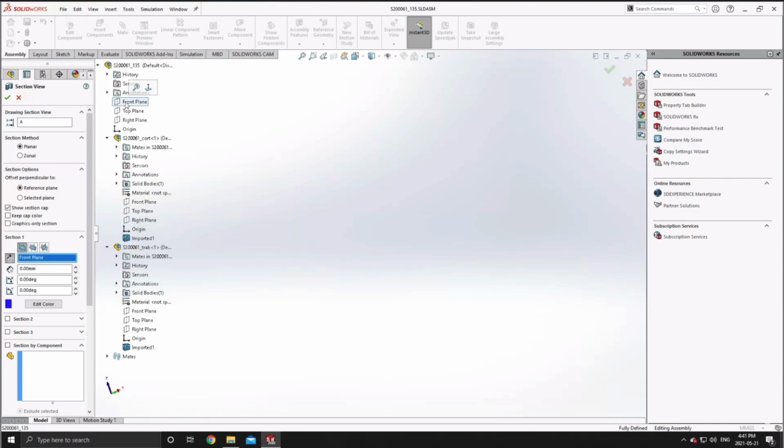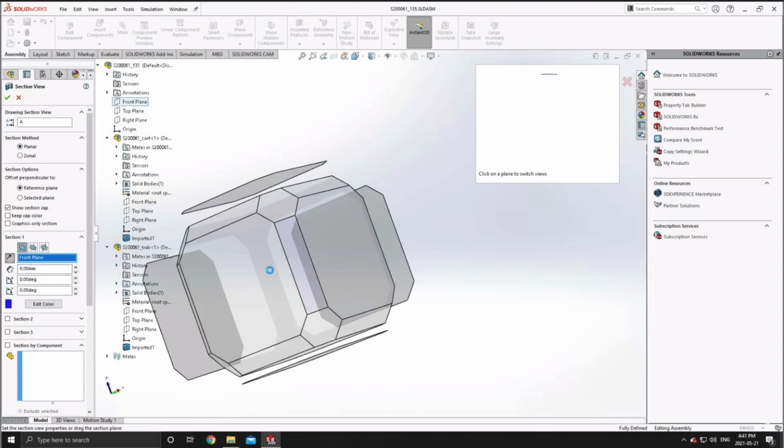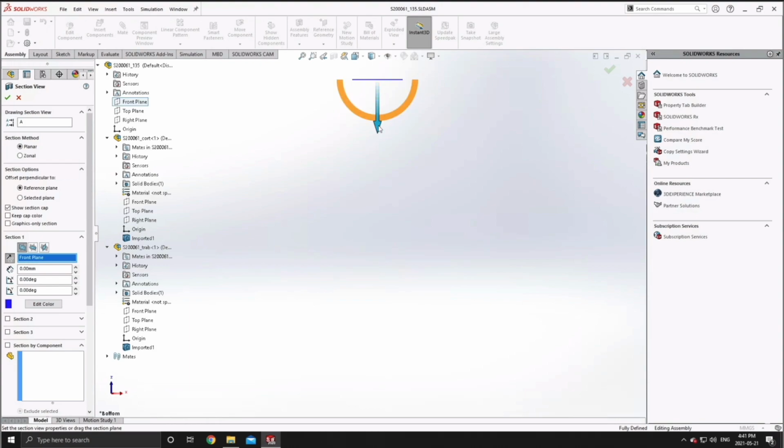So in order to mimic the surgical procedure by which a humeral stem is usually installed into a patient, essentially what we're doing here is we're mimicking the procedure by which an operating team will position the extramedullary cut guide. Now, in the context of in silico methodologies, we're actually able to perform this procedure much more analytically than a surgical team would.